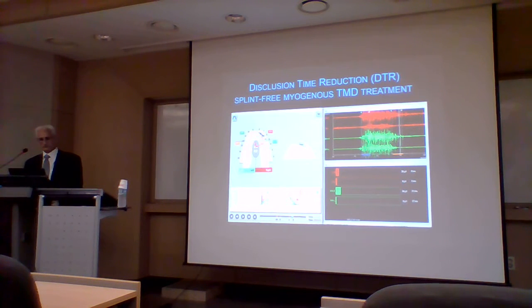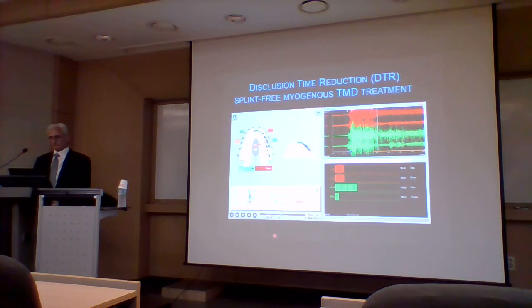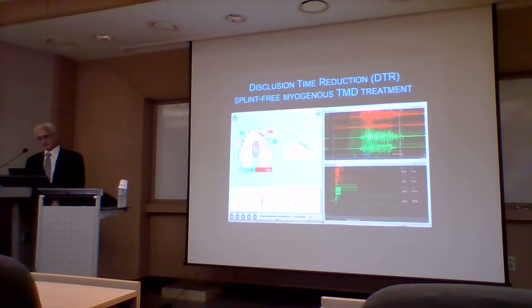지난번에 얘기했던 것처럼 레터럴 할 때 음식을 선택되는 시간을 갖다가 확 줄여주는 거 굉장히 중요하다는 말씀이죠. The disclusion time is measured from where the excursion begins until where the anterior guidance takes over. So in this pre-op, the disclusion is infinite. The anterior guidance never takes over. But in the post-op, the anterior guidance takes over within 0.3 of a second.